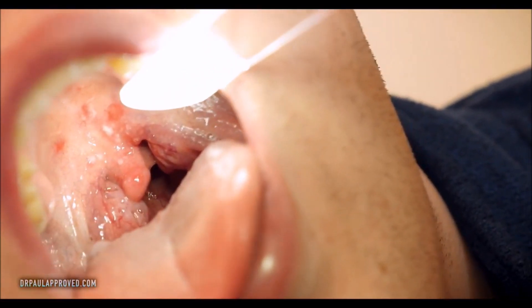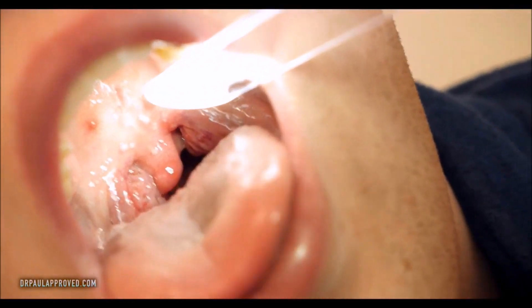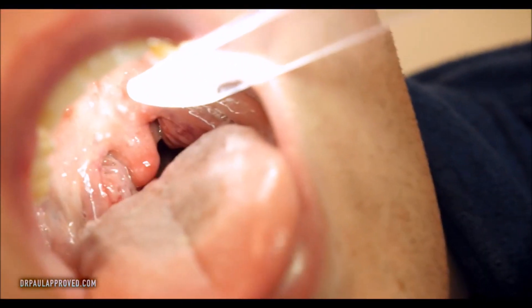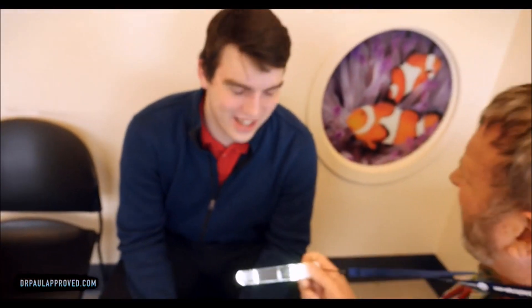If you look at the roof of the mouth, you're seeing there's lesions up there as well. Pretty gnarly looking red throat with some sort of spots on it, that kind of stuff.